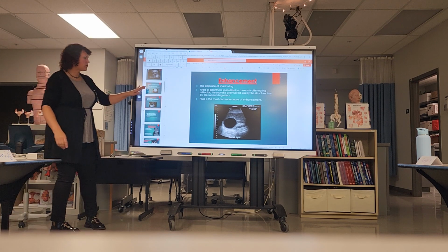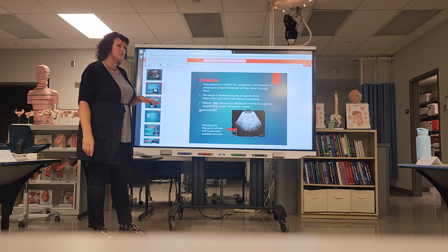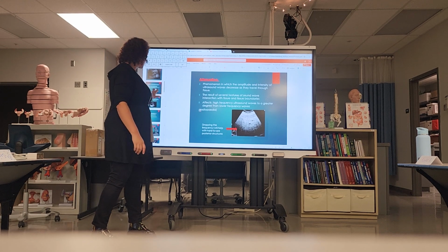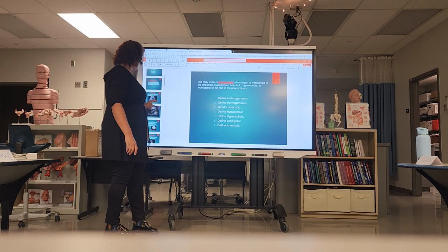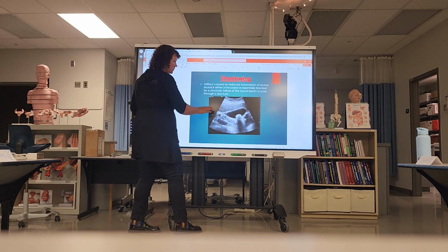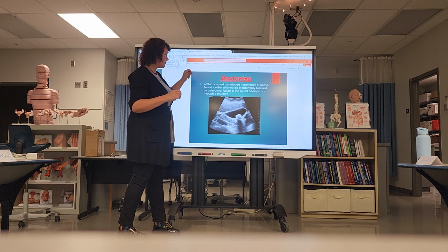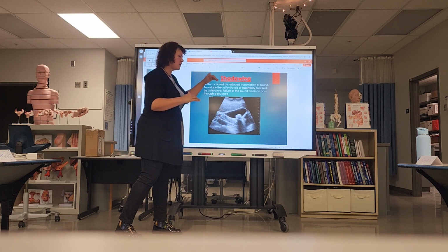So any other questions about attenuation? Between that and shadowing, if they showed us a picture for a test, it kind of looks like it's shadowing behind, but is it because the whole posterior is affected and not just a ray of shadow? Yeah, so the shadowing will be from a focus, one structure. Here, all of this is making us lose intensity.